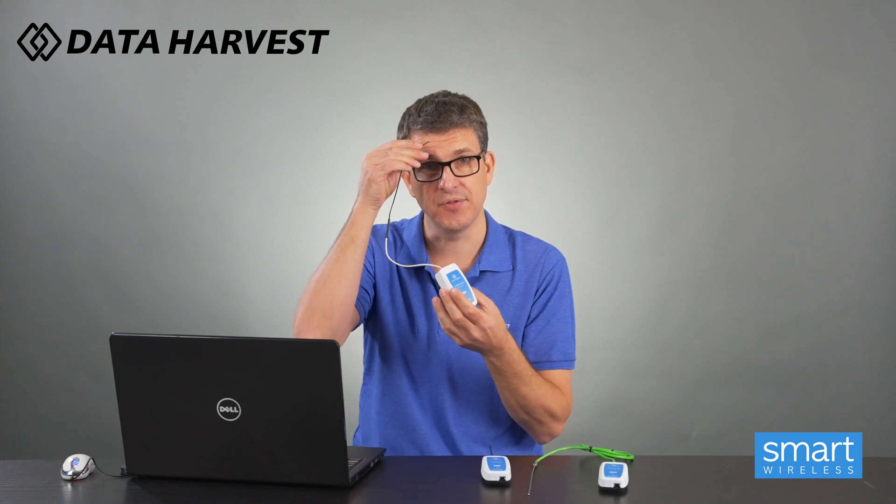You can pop it on your bicep with some tape, get a dumbbell, start doing some exercise, and you can show your muscle will increase temperature by 0.4 to maybe one and a half degrees - it does depend on the person. You can also do that on the forehead as well.